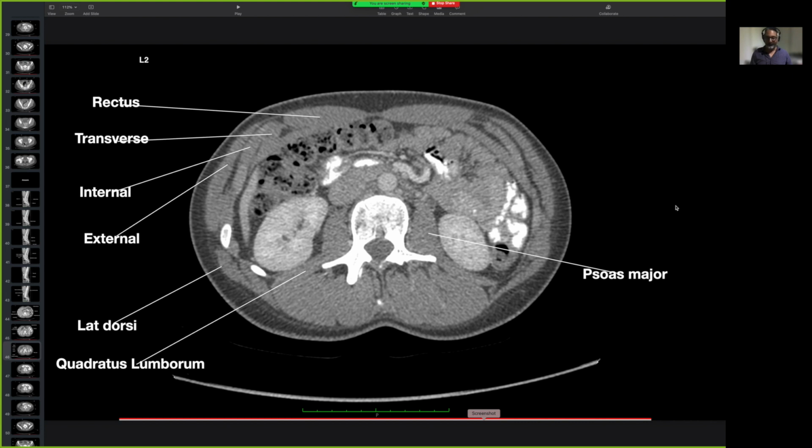Yes, they're this fat belly. This is a really thin belly here. There's a really thin belly of the Quadratus Lumborum. It's just beginning. This fat thing here is the erector spinae, and this is, yes, this is multifidus.